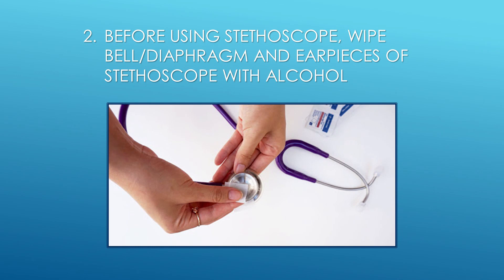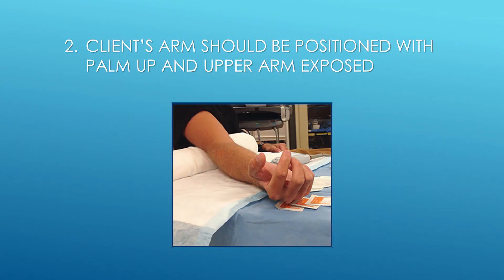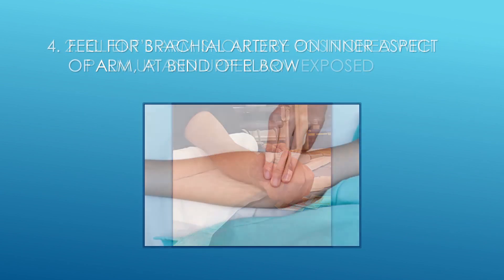Step 2: Before using stethoscope, wipe bell and diaphragm and earpieces of stethoscope with alcohol. Step 3: Client's arm should be positioned with palm up and upper arm exposed.